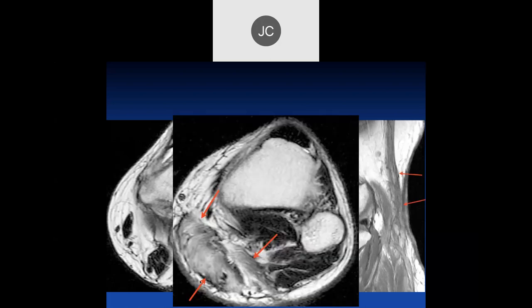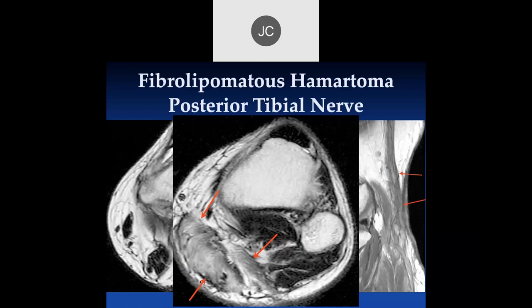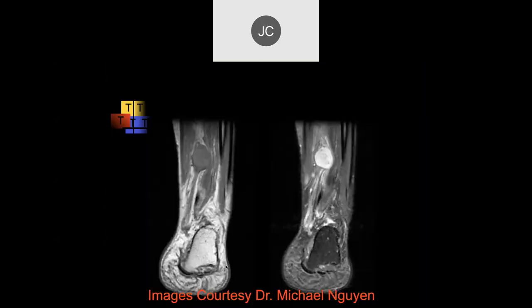They finally decided it had the same appearance as fibrolipomatosis, the hamartoma that you can see in the median nerve of the wrist, but this was one in the leg. So it's kind of similar pathology, but I've never heard of it in the leg before. Clearly it's an abnormal nerve. It probably goes up from the sciatic nerve down, involving the peripheral ones, and then you can see the denervation changes of the more distal muscles.